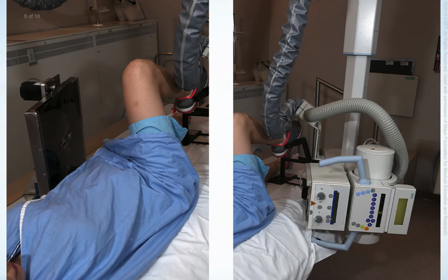Turn the image receptor vertically and position the top of the image receptor against the patient's side in the soft tissue crease that forms above the iliac crest. Angle the bottom of the image receptor away from the patient's body until the long axis of the image receptor is parallel with the long axis of the femoral neck. Ideally, a vertical image receptor holder or sandbag is used to hold the image receptor in place, but the patient can also hold it in position if necessary. Make sure the grid is positioned with the lead strips oriented horizontally to prevent grid cutoff.